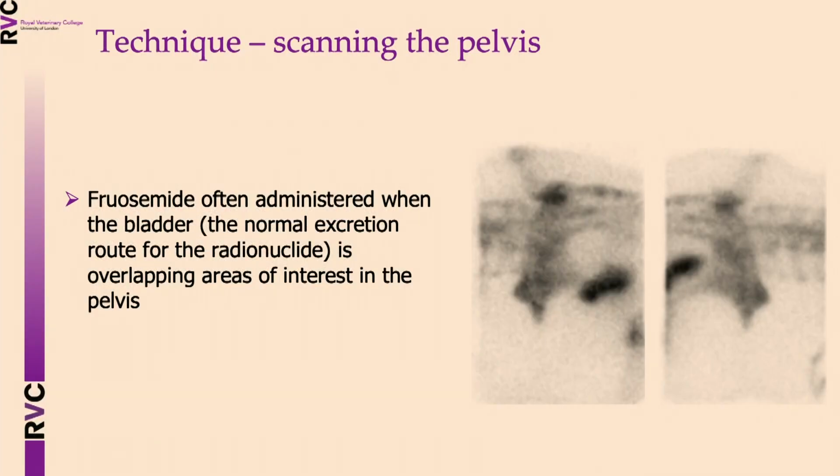During the scan of the hind legs, in particular the pelvis, we will often give furosemide, Lasix, to get the horse to urinate to evacuate the bladder.